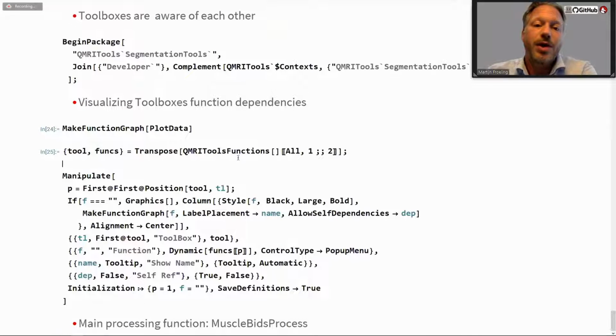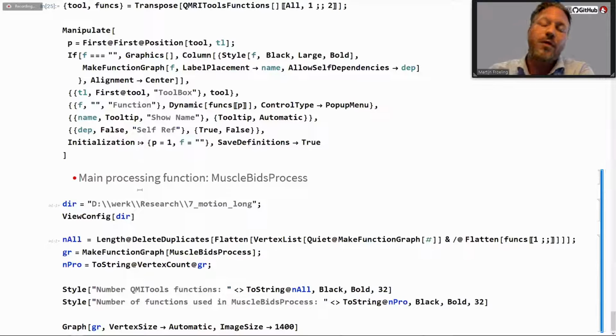When I do data analysis of one of my studies, once I have acquired the data, I have one major overseeing script that calls everything.